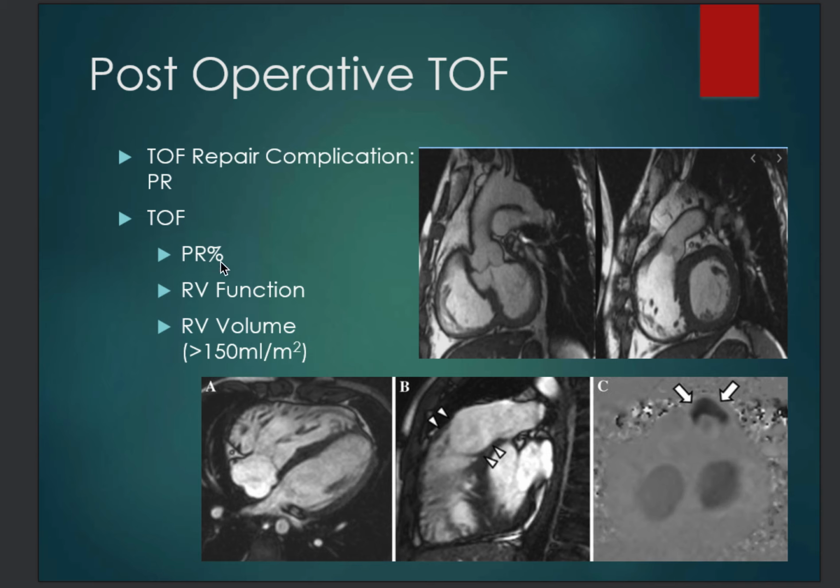Pulmonary regurgitation, if it's severe, so above 45%, or a free pulmonary regurgitation, is one of the indicators. So in the report, commenting on those parameters or the indicators of PVR is very crucial. In many scenarios, those patients will come regularly for follow-ups to see any trend of dilatation of the right ventricle, or shutting down of the right ventricular systolic function, or increased amount of the pulmonary regurgitation.